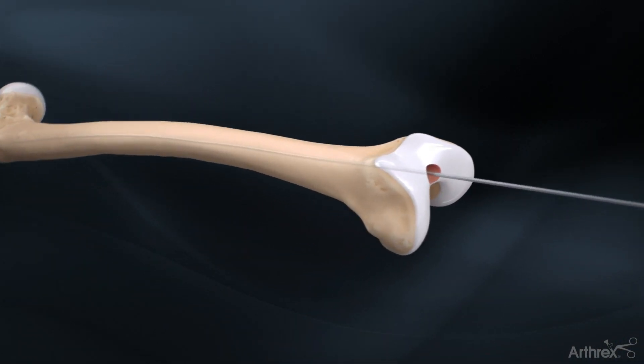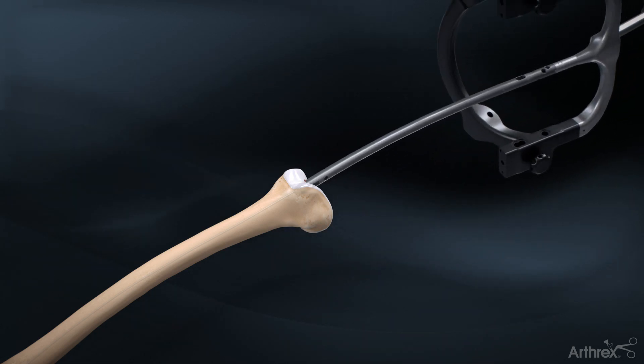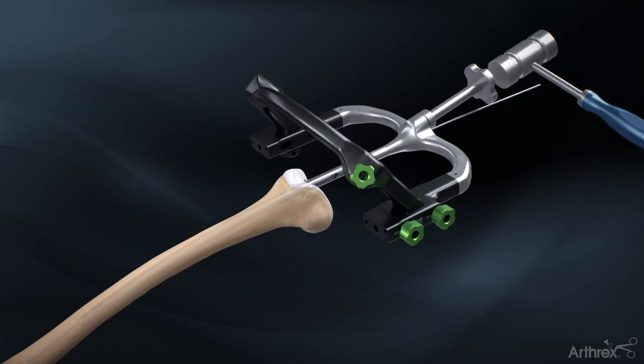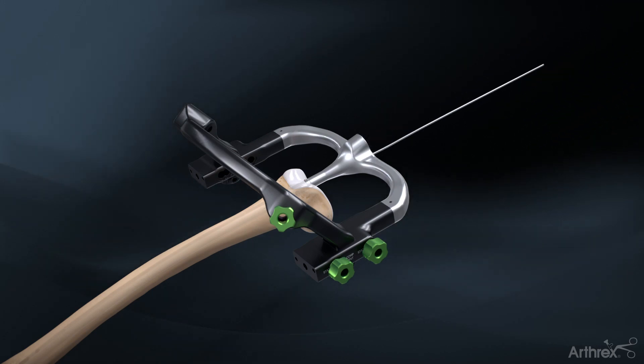Attach the nail to the retrograde radiolucent targeting guide. Introduce the nail over the ball nose guide wire and complete the insertion with gentle mallet strikes on the targeting guide impactor pad. Remove the impactor pad and the ball nose guide wire.